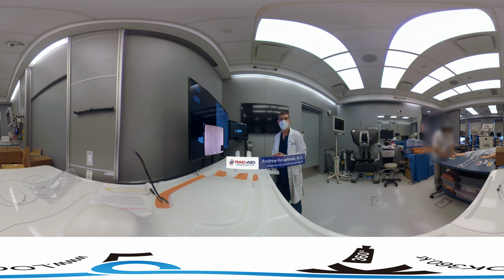And we're going to immediately, because we're trying to find the internal iliac artery where the uterine comes off on that side. And you can see the robust arterial supply to the uterus there on injection. So we're going to get down into that internal and come down a little bit farther into it. We're just going to come a little bit farther down until we get right to the area of interest, which is going to be right where the uterine artery is.